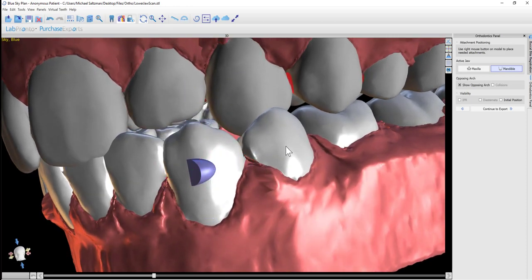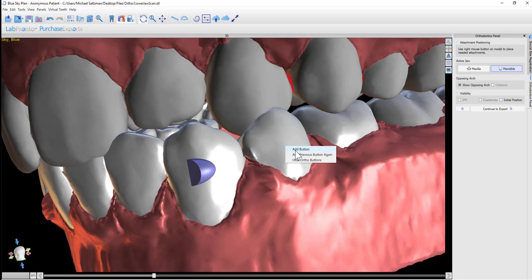If you'd like to add a button to a different tooth, right-click. You could choose Add Button, you could choose Add Previous Button again, or Hide Ortho Buttons.